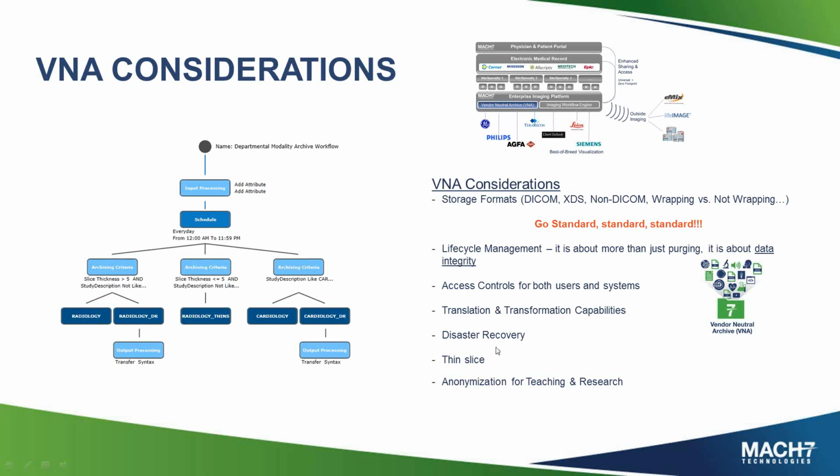Can it help out with thin slice management? Can we purge off thin slices after a couple of years? Can we anonymize studies for teaching and research? So a bunch of things to think about when you're looking at a VNA.